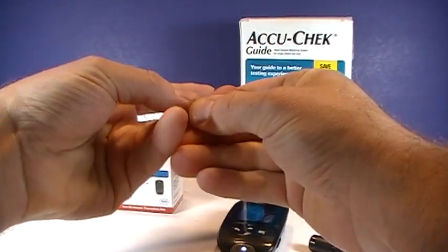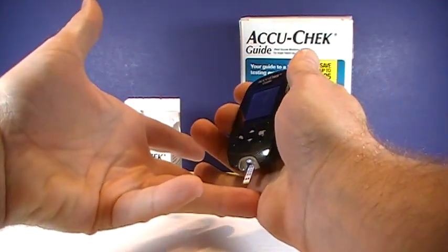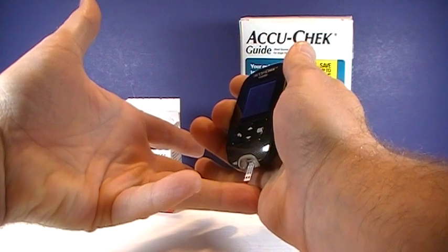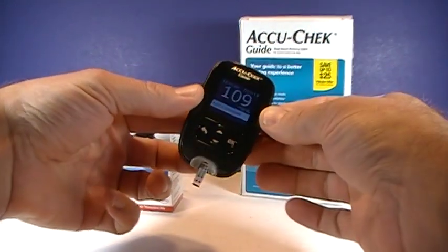You can gently massage the finger — you don't want to squeeze or milk the tip, but just a gentle massage. Then you go ahead and put that on the drop of blood. It says 'remove' right there — 109.